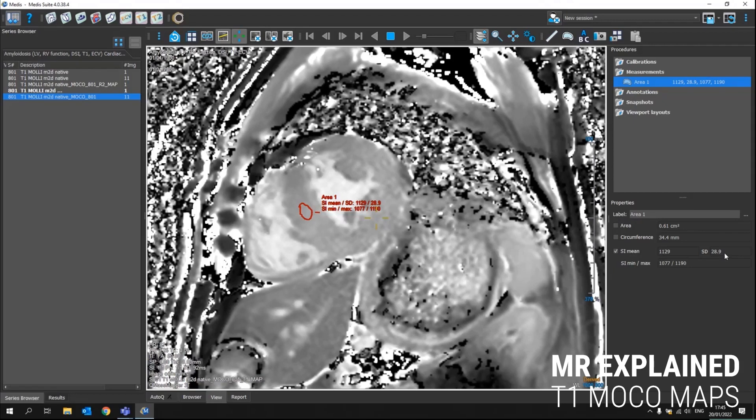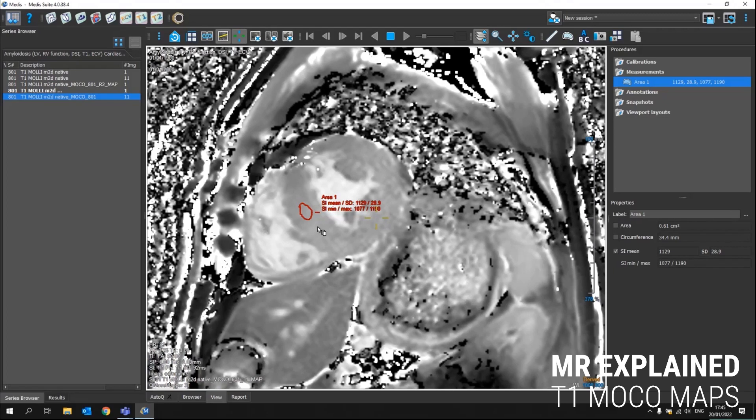It will also provide you with a standard deviation and a minimum and maximum T1 value in this region. So no need to open any additional applications from here. You can already get the T1 values.